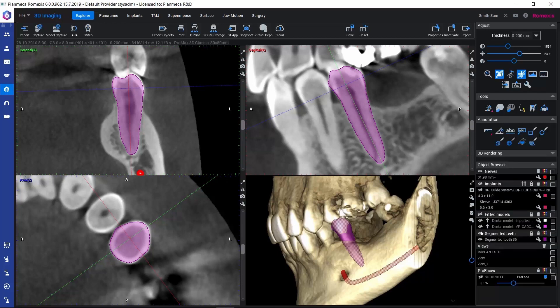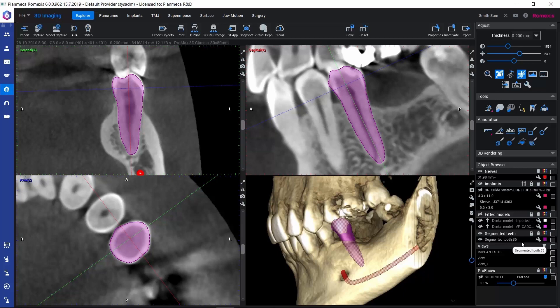Now we can see our segmented tooth here in the object browser — this is where we can manage it. We can hide and show it through the eye icon. We can change the color by clicking on the color box, which is useful if you have several teeth segmented, so we can recognize them better with different colors. The tooth number picked in the wizard also shows here next to each segmented tooth, and we can also delete the tooth here using the object browser.